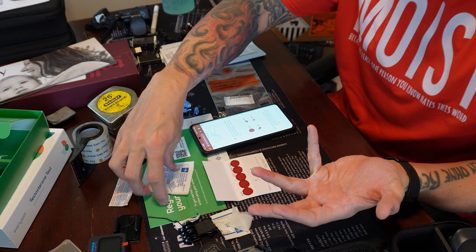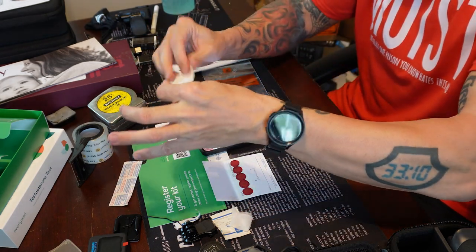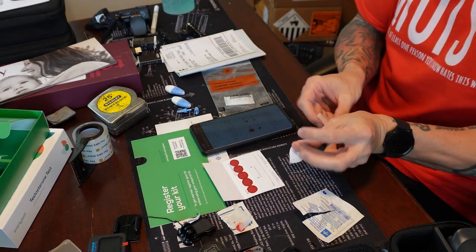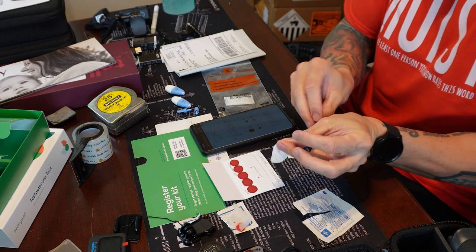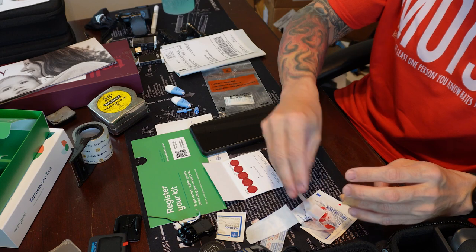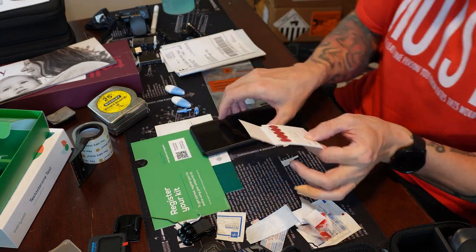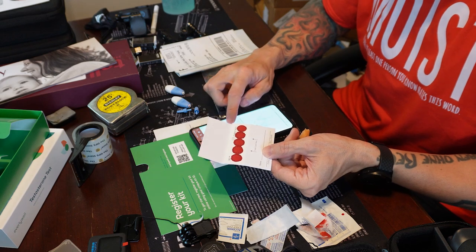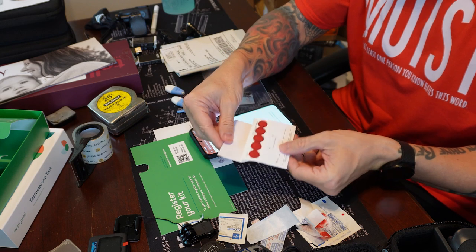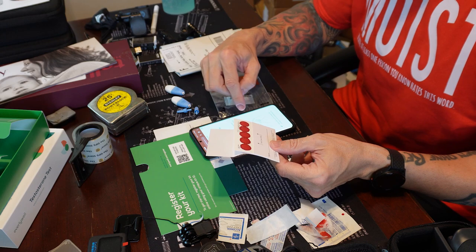We've got all five circles filled. Take the gauze and put it on the finger, seal it with a band-aid before bleeding all over the table. Now that the band-aid's in place, check the back of the card and make sure that the blood has come through, which it has. Leave the card to dry for 30 minutes or until completely dry.